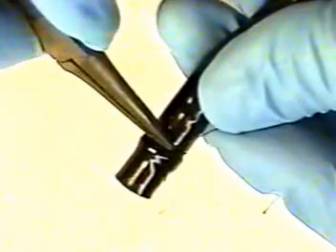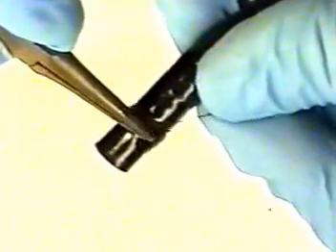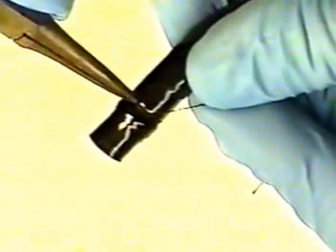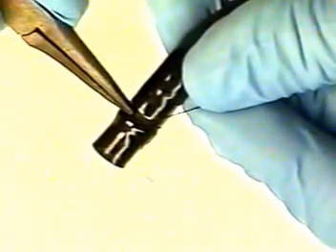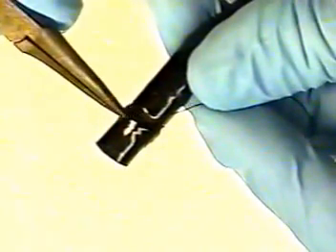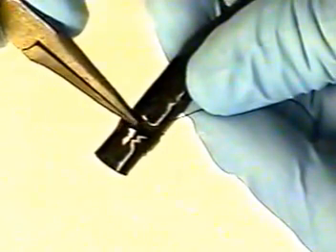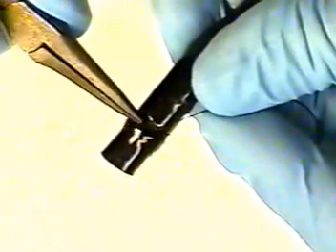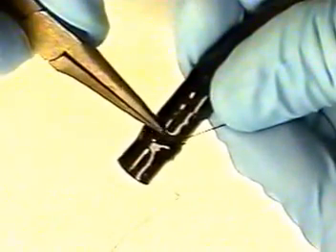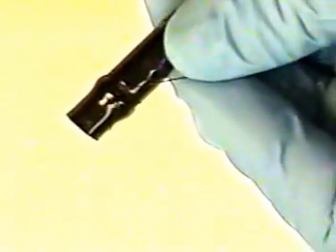If you pull the loop completely out of the bindings, you will have to repeat the procedure, because it should be very tight and right up against the distal end hood. Again, be sure that all these bindings are very tight. This binding should not allow any air to escape from the bending rubber through the bending section. It should be airtight even without the glue covering our bindings. Take your sharp scissors and cut off excess binding thread approximately 1 inch.